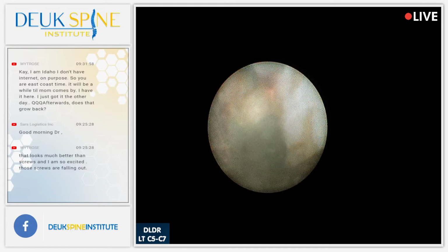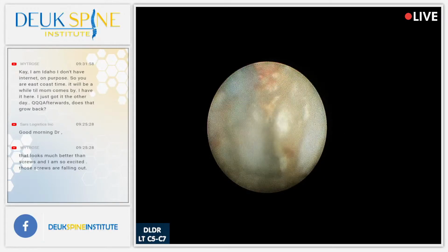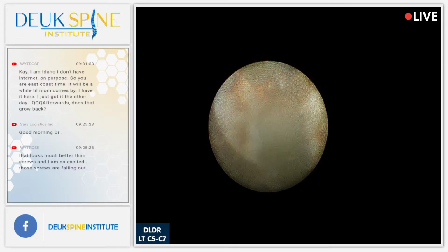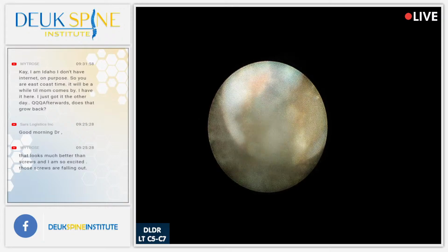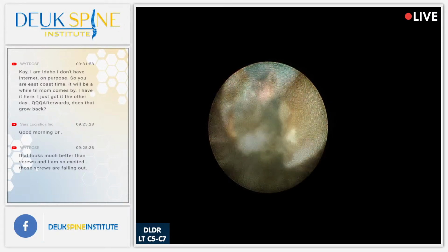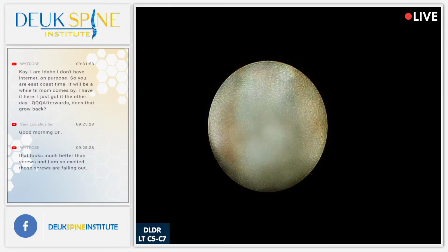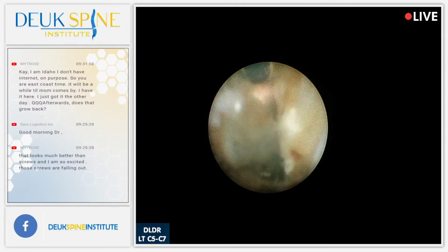And then their question is, afterwards, does that grow back? Yes, this will grow back.